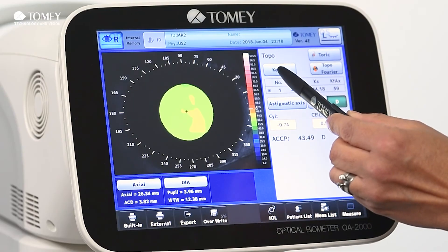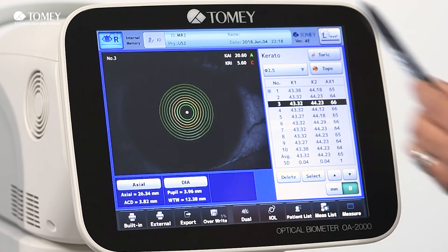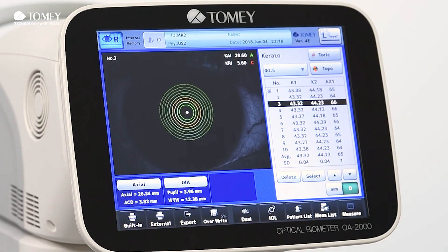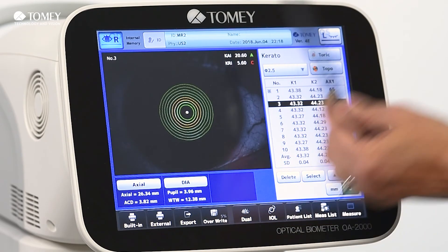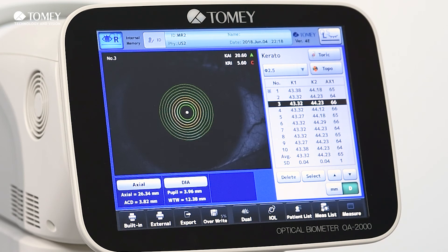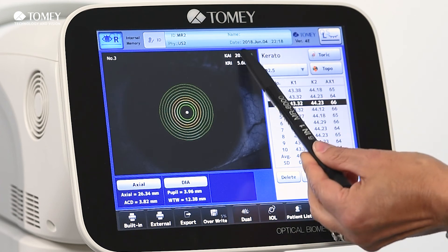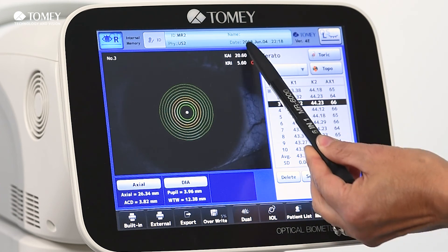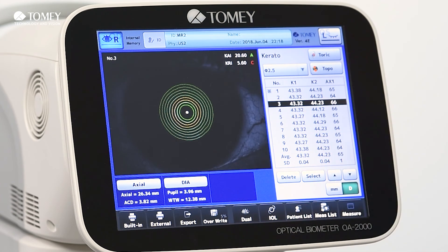When we go back to keratometry, we have two more values displayed: the asymmetry index and the regularity index. Again, these use two colors so that you can see right away if a value is normal or not.